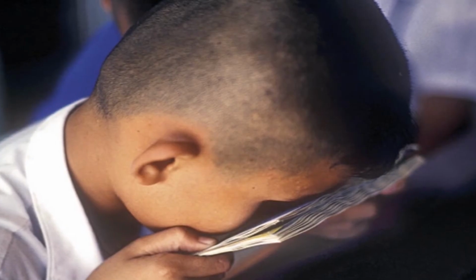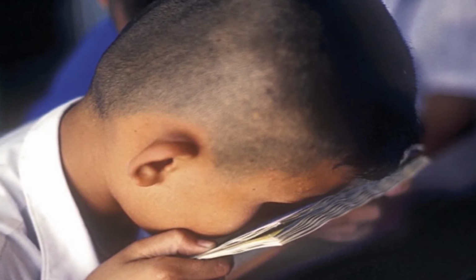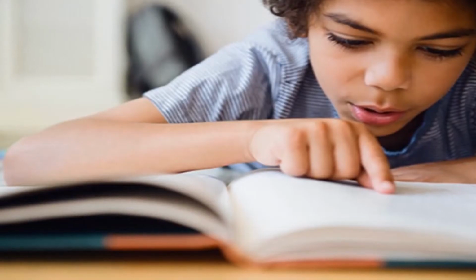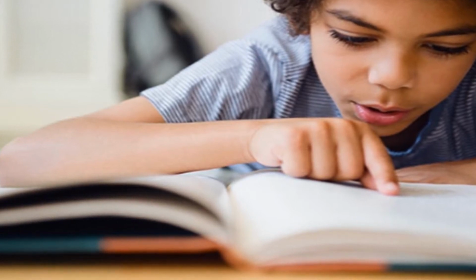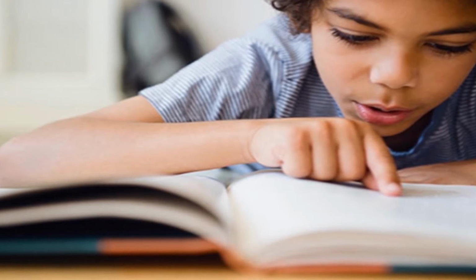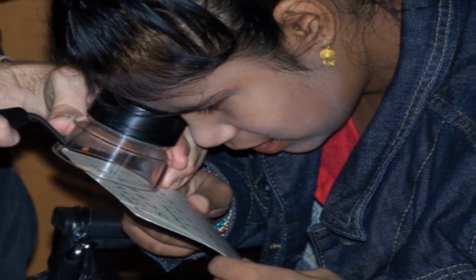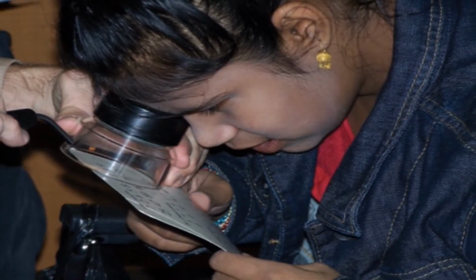Most children with low vision can significantly increase their near visual acuity by employing their strong ability to focus on nearby objects or by squinting to produce a pinhole effect if they have poor accommodation. Children with low vision normally achieve the required magnification by the approach method, that is, the relative distance magnification. Some children need optical devices along with relative distance magnification to see the target clearly.